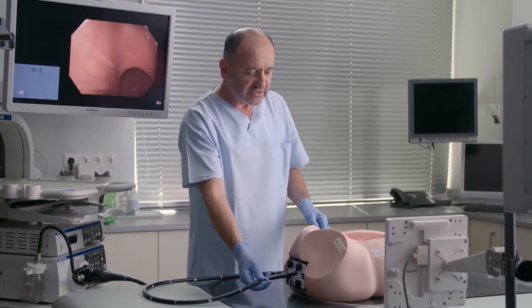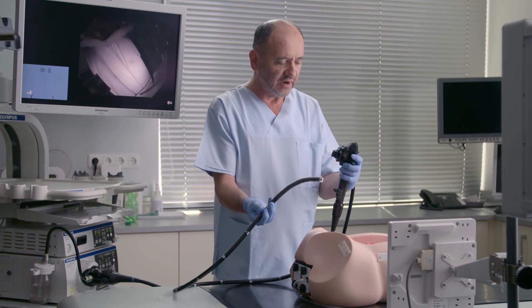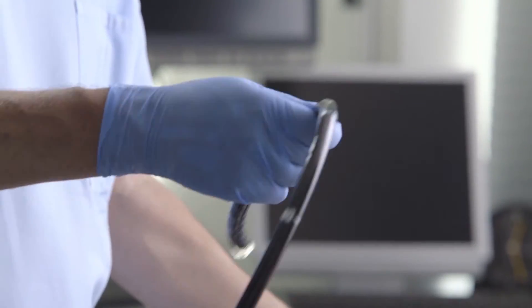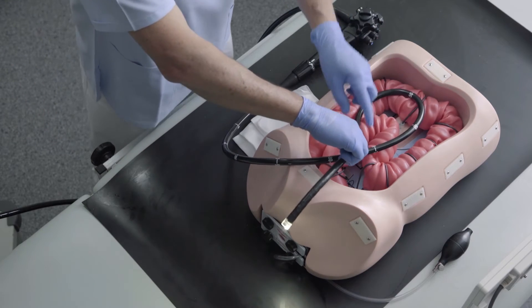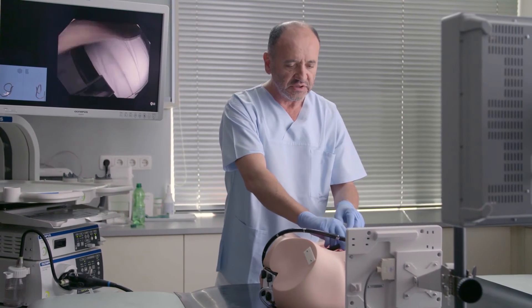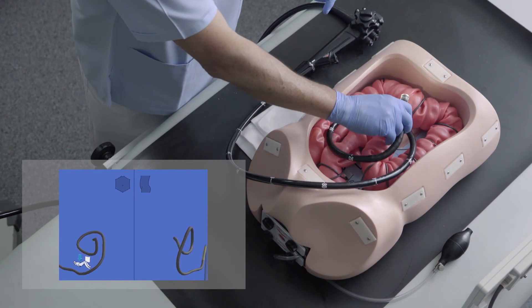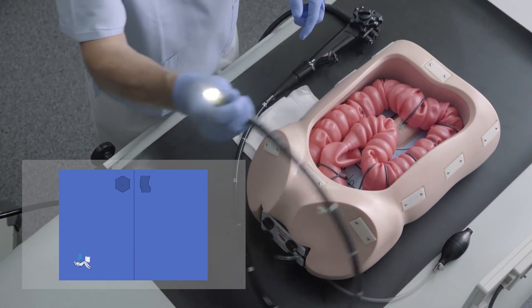To do this task, we have this Olympus instrument, which you have the possibility to control here with your left hand, and the instrument is quite flexible and adapts to the colon. We also have the scope guide, as you can see on the monitor here on the screen, which is representing what we see inside the colon.